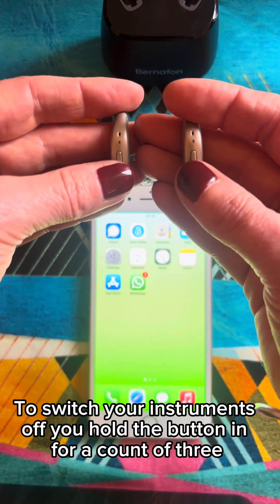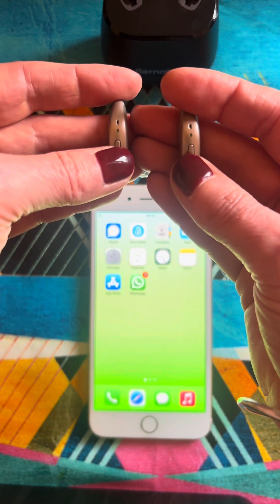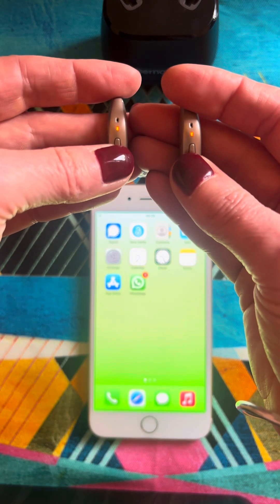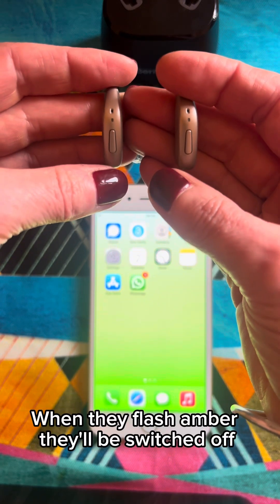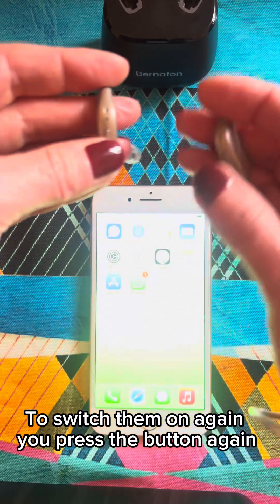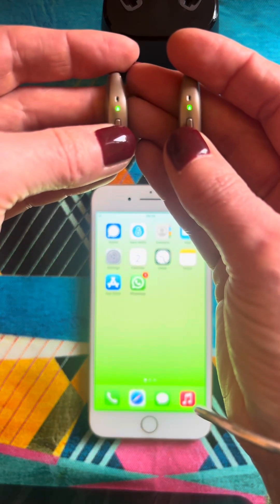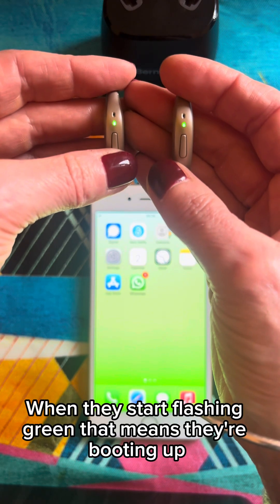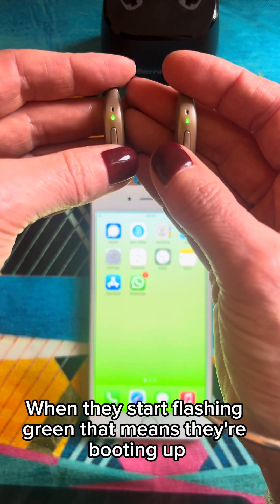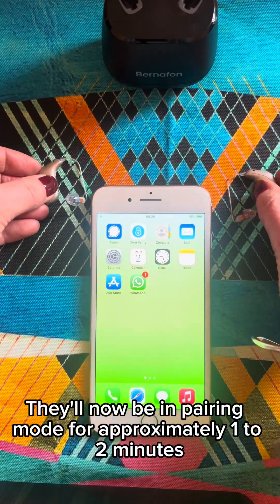To switch your instruments off, you hold the button in for a count of three. When they flash amber, they'll be switched off. To switch them on again, you press the button again. When they start flashing green, that means they're booting up. They'll now be in pairing mode for approximately one to two minutes.